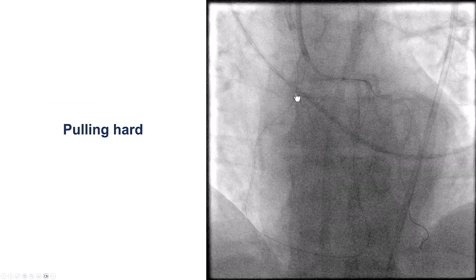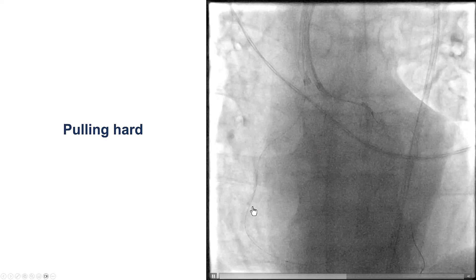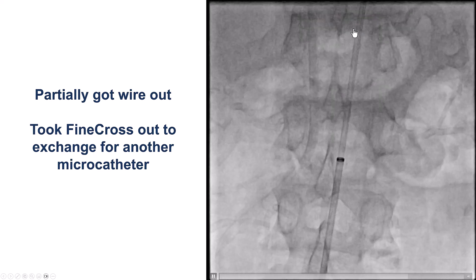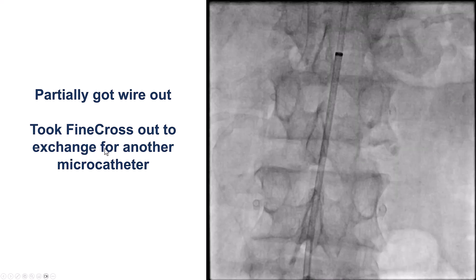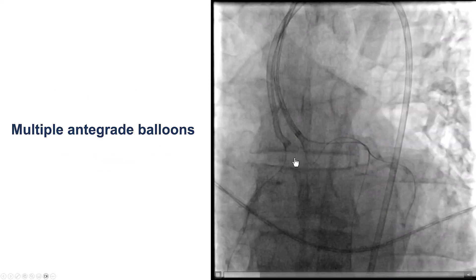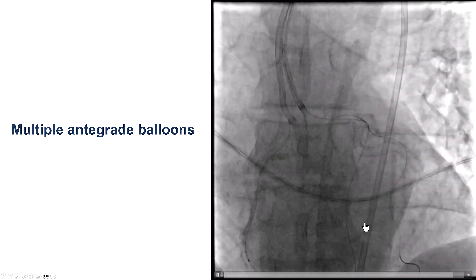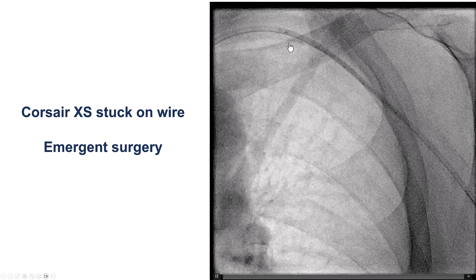We tried to pull the wire back, but had a lot of difficulty pulling it back, likely because of severe calcium and tortuosity. Eventually we were able to partially move it down. We still had the Fine Cross microcatheter inside, and tried different antegrade balloons and microcatheters, but could not get the retrograde wire to come further back. After multiple attempts, the patient ended up going to surgery — we just could not remove the retrograde guide wire from the coronary artery.